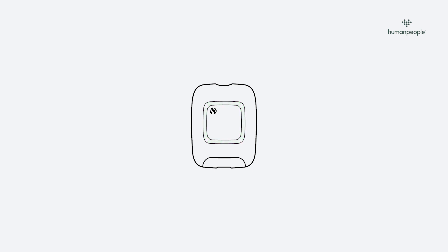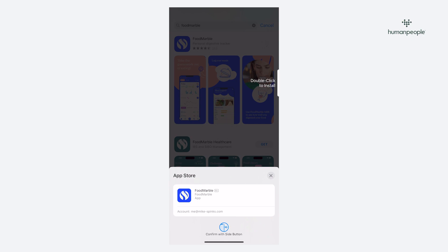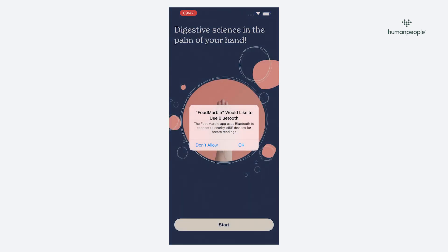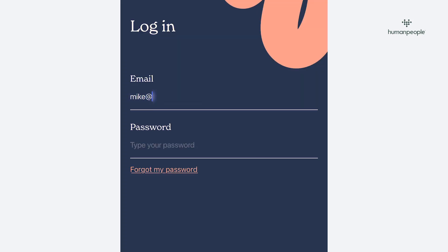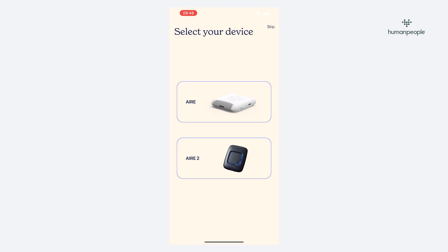The light on the device will show green once fully charged. You can download the FoodMarble app from both the Apple App Store and Google Play Store depending on your mobile device. Make sure you download the blue app. Follow the instructions and login using the account details you previously created, then connect your FoodMarble device by following the on-screen instructions.